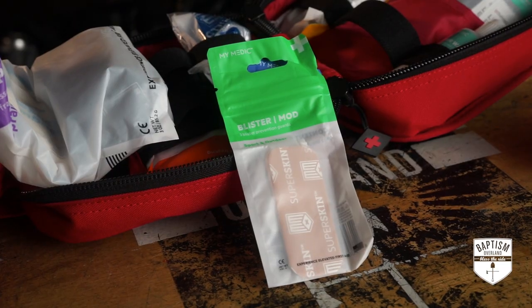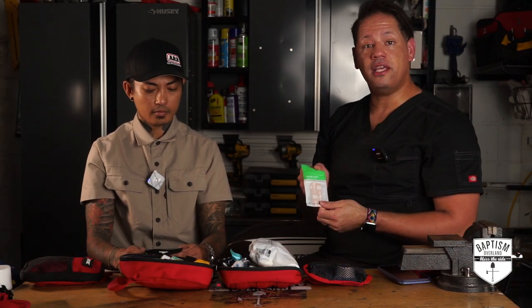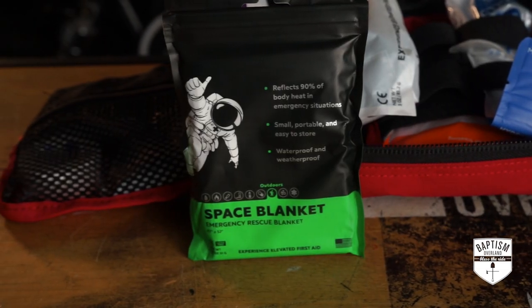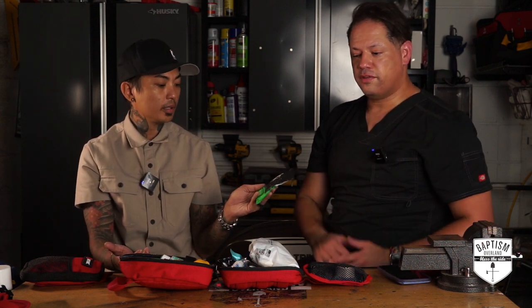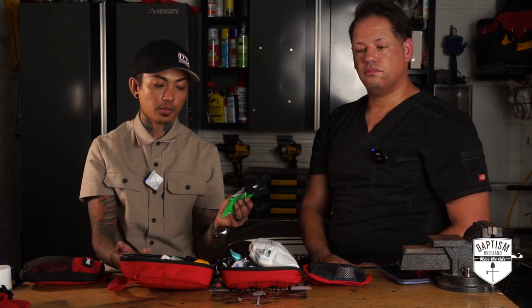Blister mod — when you're hiking and wearing boots, you'll obviously get blisters on your toes, heel, or bottom of your foot. Having something to cushion and protect the blister so you're not re-injuring your skin is definitely important. Space blanket — hypothermia is very common. It's a rescue blanket that reflects 90% of body heat in emergency situations.